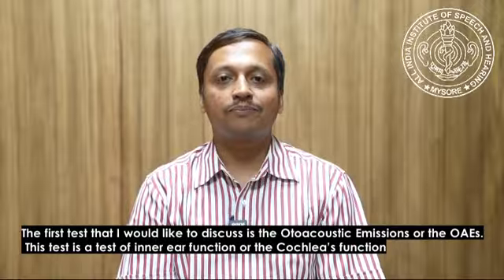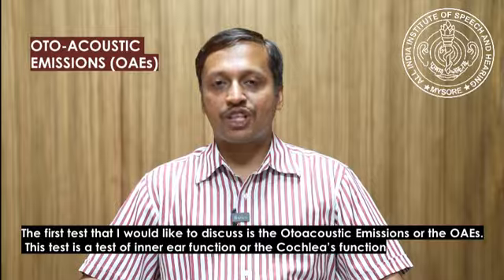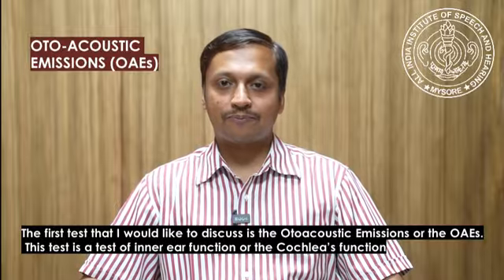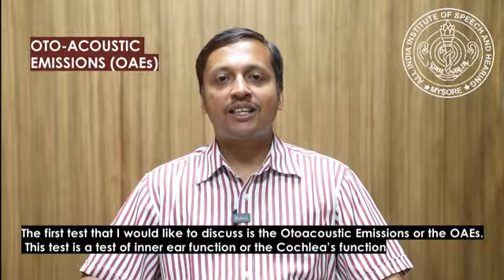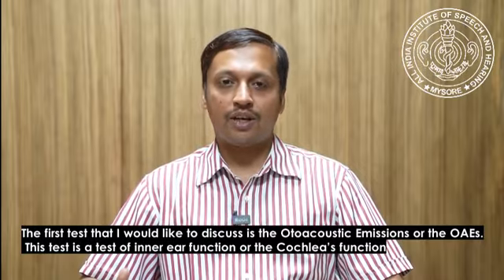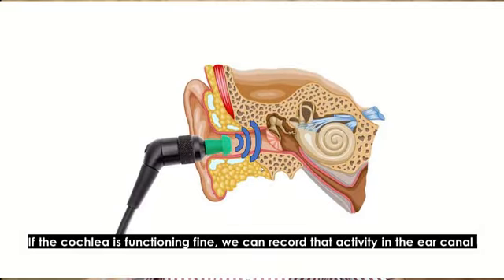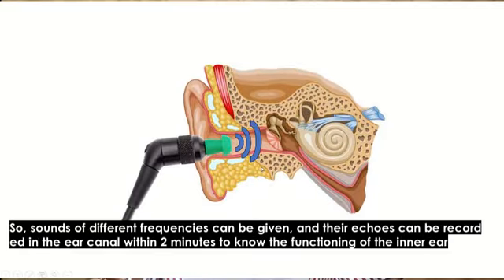The first test that I would like to discuss is the Otoacoustic Emission or the OAEs. This test is a test of inner ear function or the cochlea's function. If the cochlea is functioning fine, we can record that activity in the ear canal. Sounds of different frequencies can be given and their echoes from the cochlea can be recorded in the ear canal within 2 minutes to know the functioning of the inner ear.